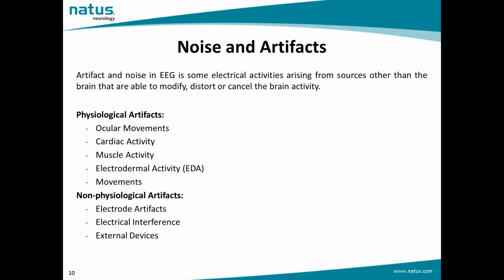For this reason, the identification and the removal of artifacts and noise are two big issues and challenges in EEG, both for technicians who record the EEG signal and doctors who interpret the brain activity.